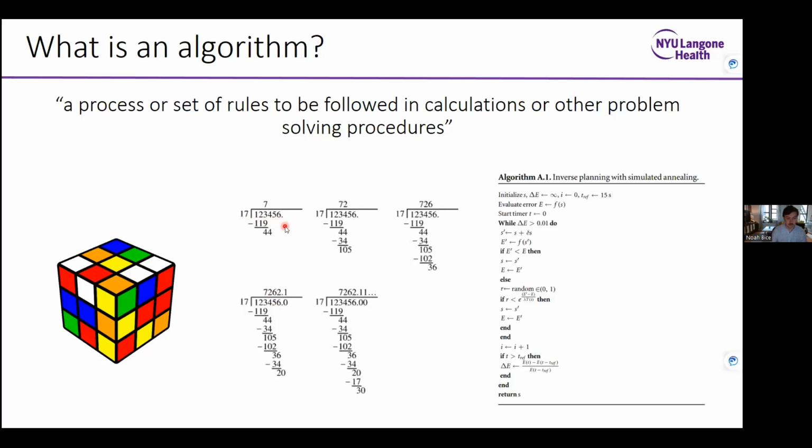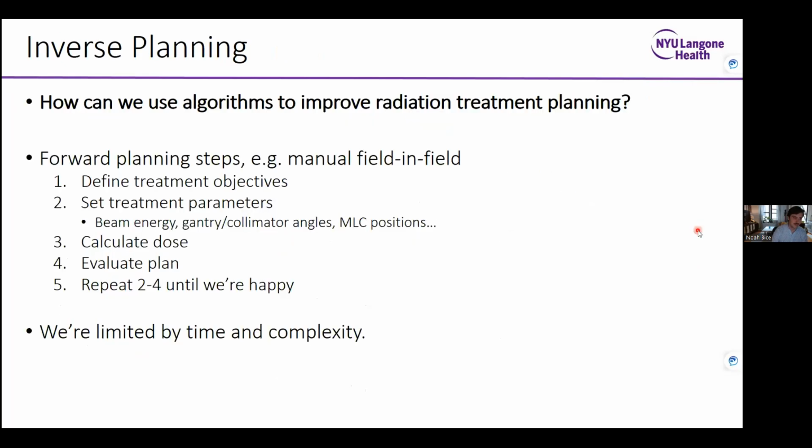And of course, algorithms are implemented in other day-to-day activities like solving a Rubik's cube, and for us in treatment planning. So this is an example of the steps written out for inverse planning with simulated annealing, but we'll cover that in more detail in a moment.